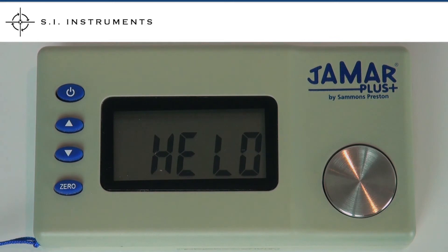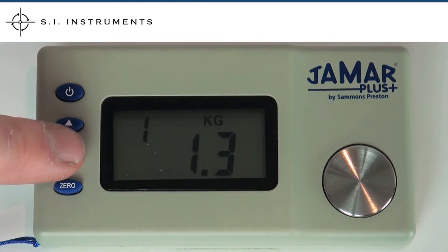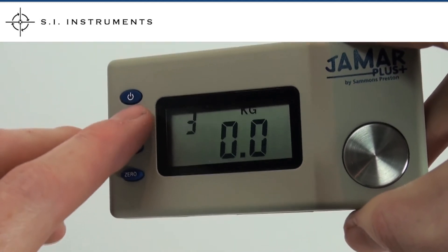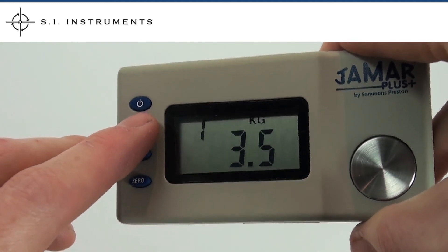The JMR Digital Pinch Gauge can store up to 100 readings. To store a reading in the memory, simply navigate down after recording a reading. To navigate between recordings, simply use the up and down buttons.